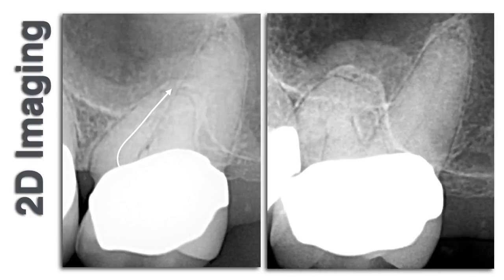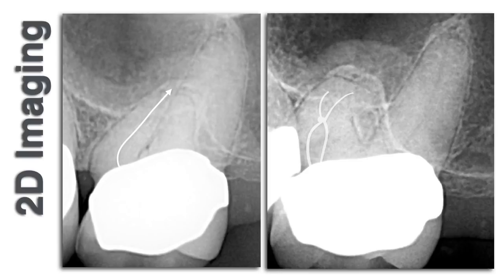Looking at the distal view of this mesial buccal root, despite this wild curve at the cervical area, we can see some very unusual anatomy. It's rare to see this kind of 3D anatomy in our 2D imaging, but in this case we're lucky. This is what was in there: an MB1 and MB2 confluent mid-root. It looks like a little knot there almost, and then a bifurcation of that canal system.